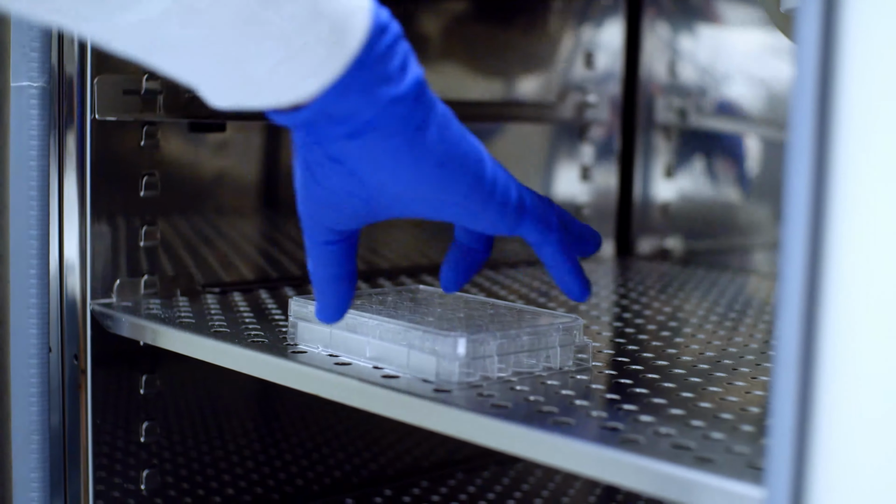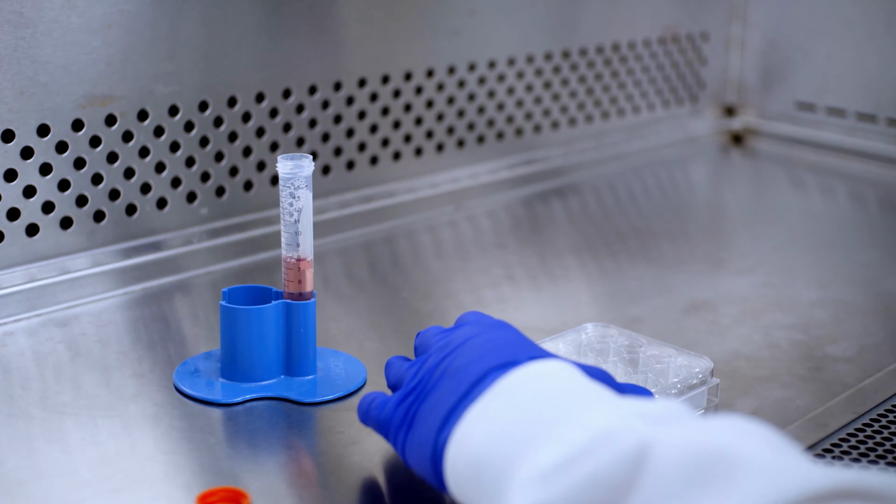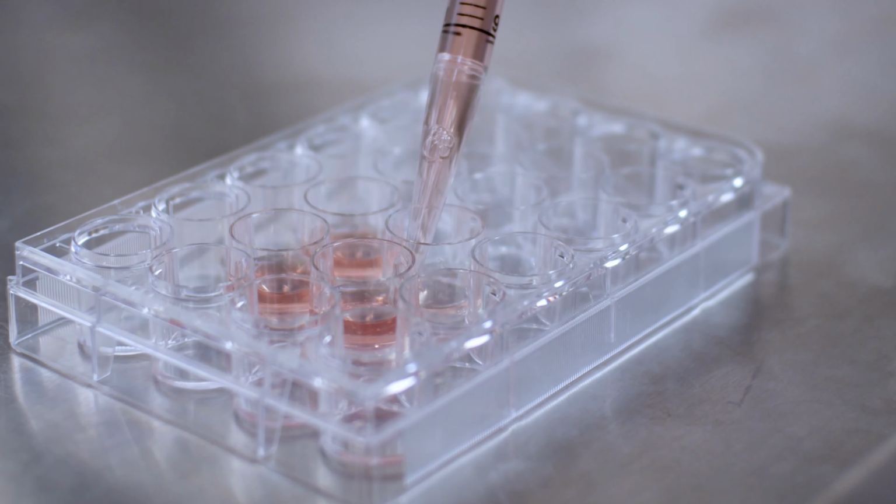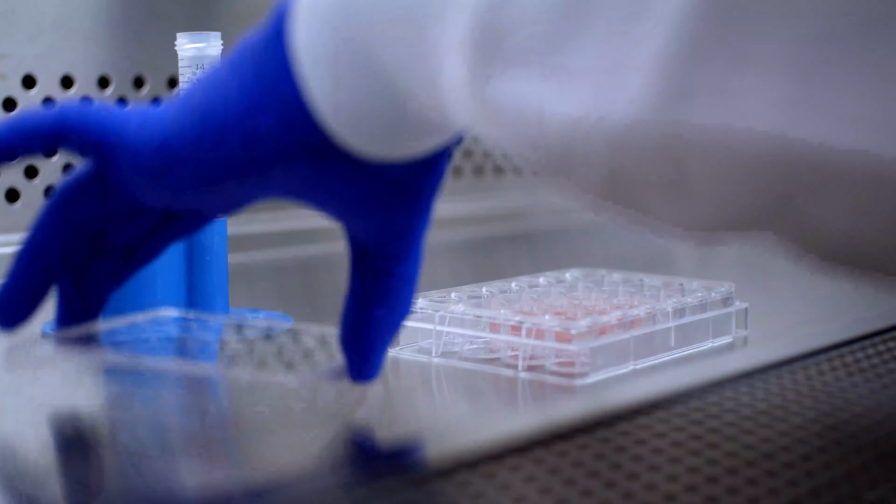Once solidified, aspirate any unpolymerized material and rinse with serum-free medium. Add the appropriate cell culture media to each well while being careful not to disrupt the matrix surface.